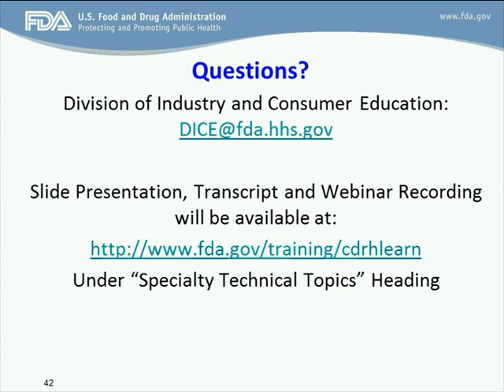Again, that depends. If you're recommending 6 independent cleaners independently and 3 disinfectants independently, and it does not matter how the user uses them, you can validate each independently. Then again, it depends on what specific instructions you are providing in your labeling. Whatever instructions they're providing in your labeling, that needs to be validated. Okay, thank you.